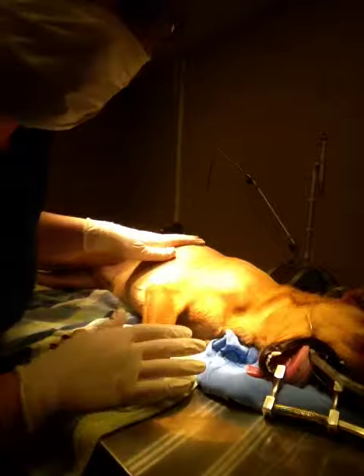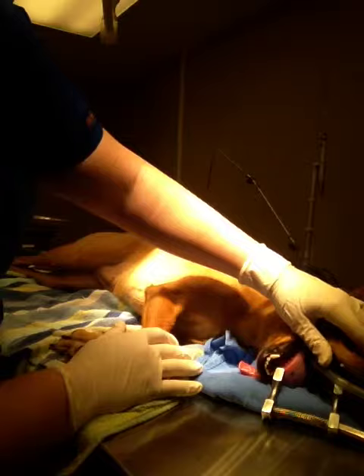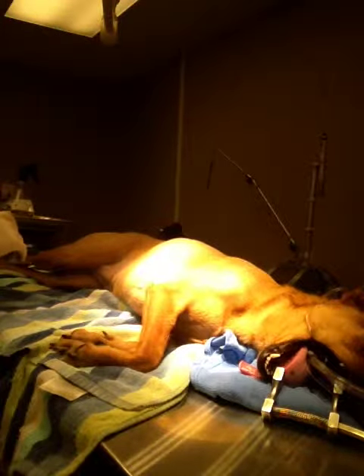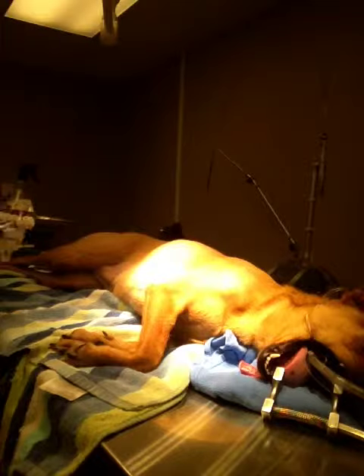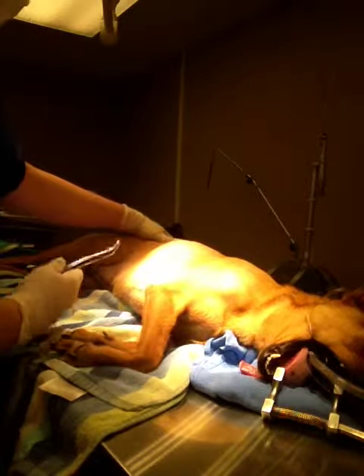She's breathing really well. We also try not to keep them on a high stage of anesthesia while they're getting a dental. It's not as invasive, but it's invasive. She also got an IM injection of penicillin.